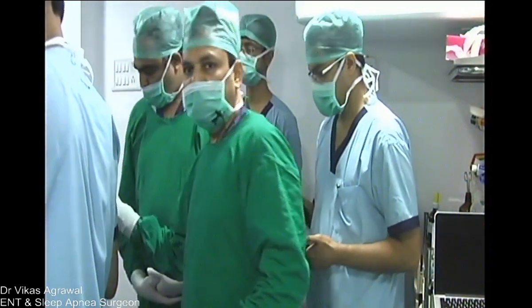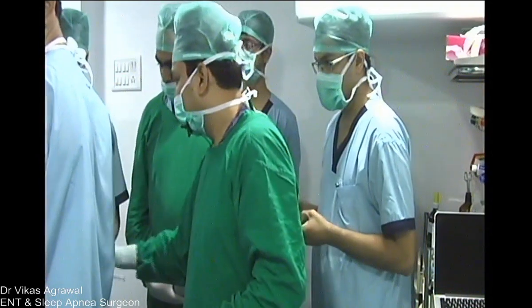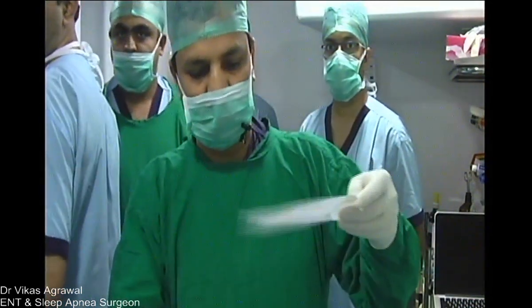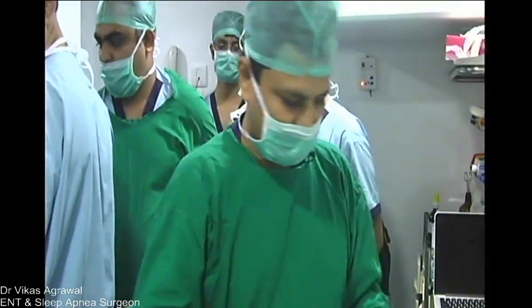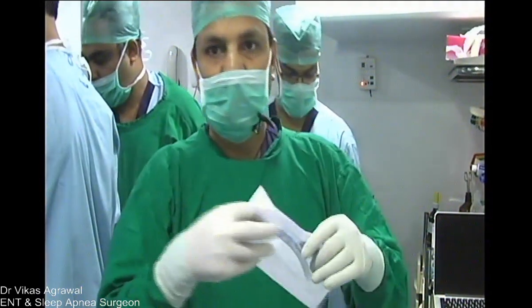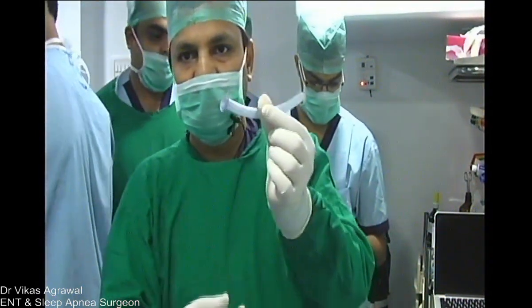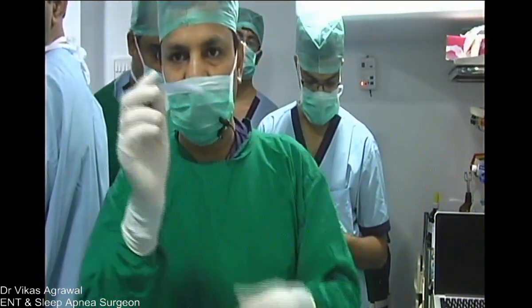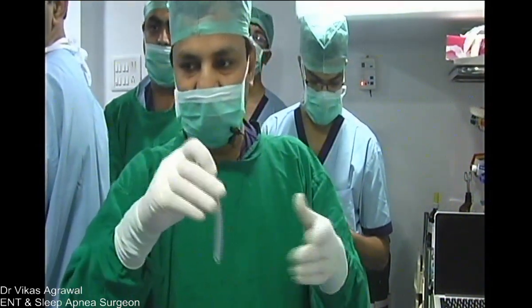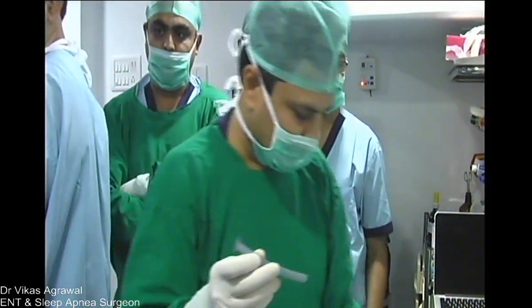Yeah, so we can show the nasopharyngeal airway. So this is the nasopharyngeal airway. I'll just open it for you. This is the nasopharyngeal airway, which many times we put in the nose to keep the palate open to assess the result of palatal surgery, what is going to happen.